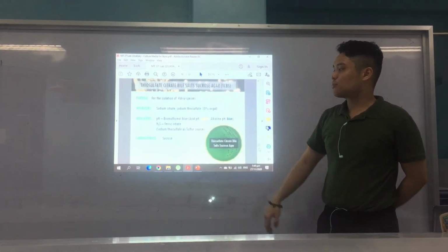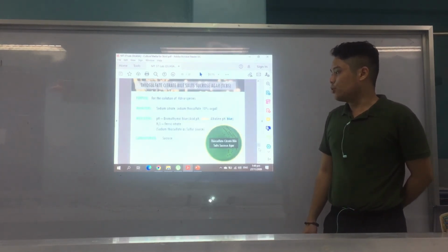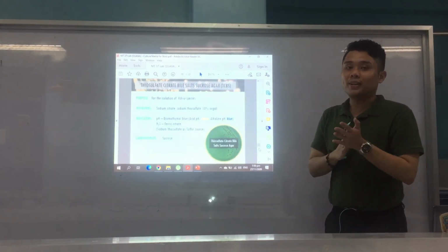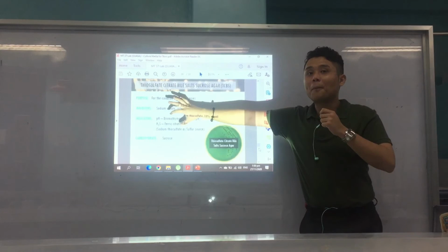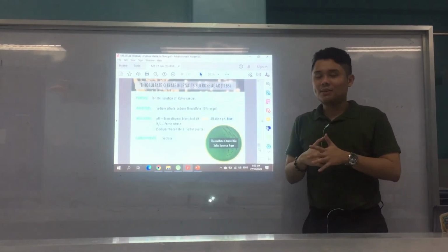Okay? And the pH indicator is bromothymol blue. Acid pH is yellow, alkaline pH is blue. H2S this time is detected with ferric citrate. Okay? And the sulfur source is still sodium thiosulfate. Okay, so if I'm not mistaken, the point of ferric citrate, like in the previous media, is that they combine to form the precipitate. Okay? So the ferric citrate. If I'm not mistaken, I'll have to check.